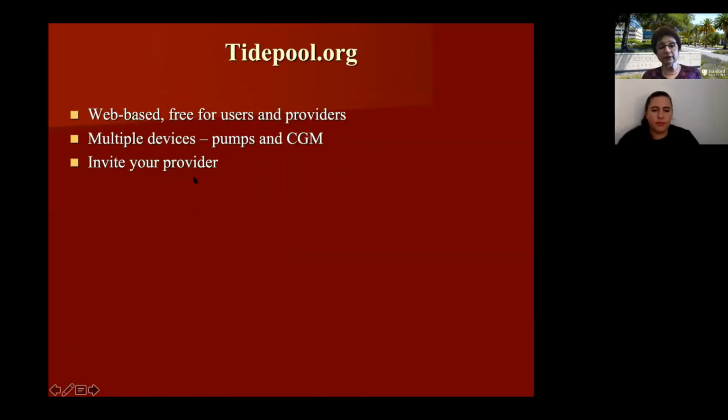And we talked about Tidepool. You can invite your provider. The great thing about Tidepool is that I don't even need to know your login and password. Once you invite me to your team, then with my own login and password, I can see the data once you upload it.